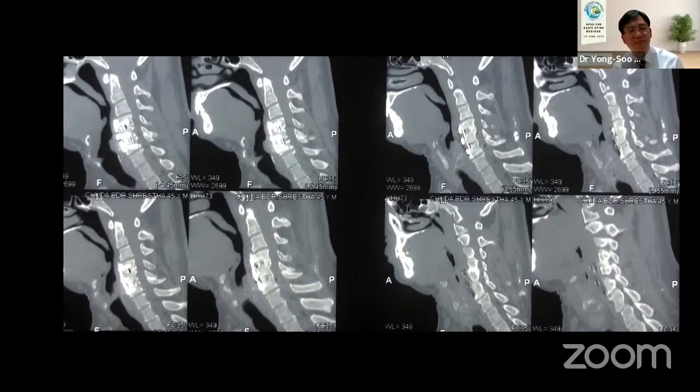Yeah, but what I can appreciate from these post-operative CT scans is that a majority of the osteophytes have dissolved also. And there is a good canal clearance at the two levels where there was maximum compression. What do you say, Dr. Amrit?